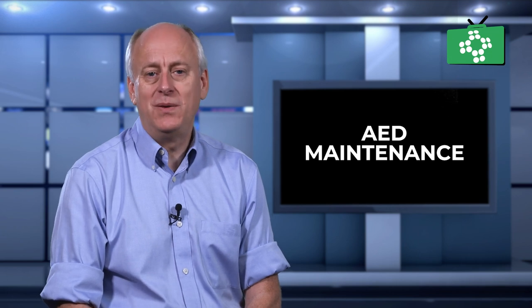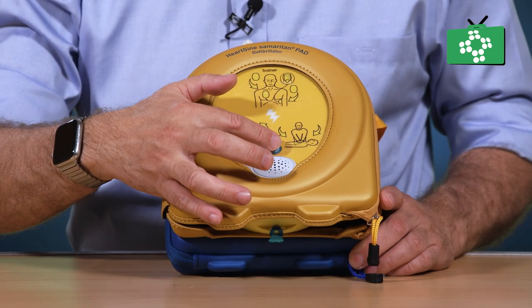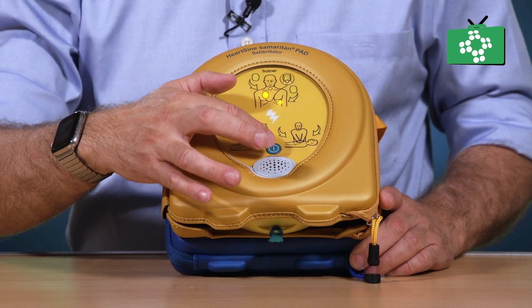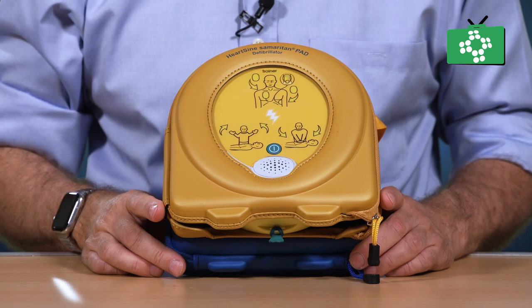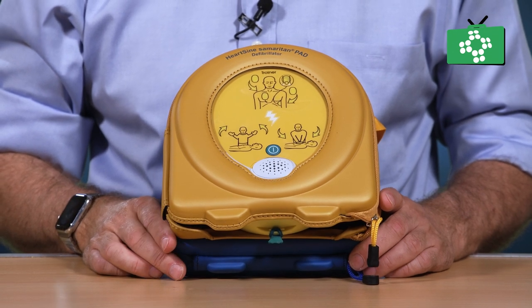When you have checked the unit visually, put it back in the case. To test the AED unit, push the start button and it will work through the initial analysing cycle with the lights flashing and the correct voice prompts. You then know that the unit is ready to use.